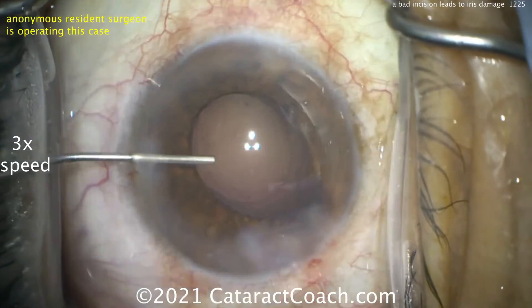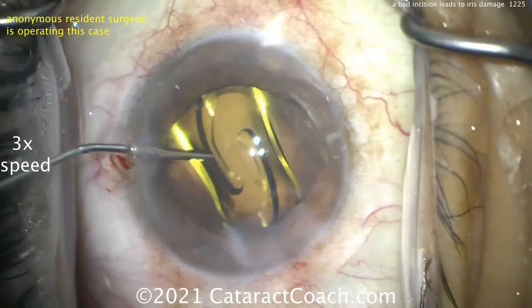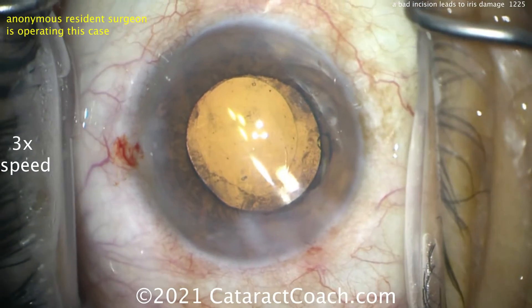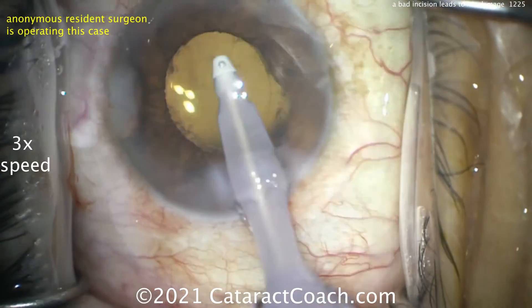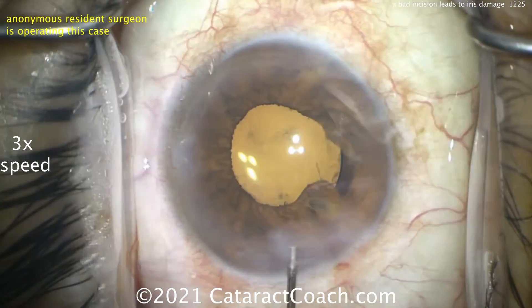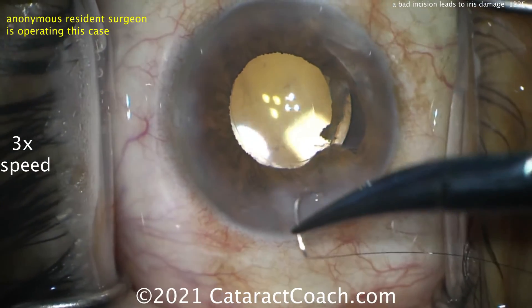Luckily, it looks like the case is going to be able to be finished normally. Putting in some more viscoelastic — let's see if we can get the lens in the capsular bag. Certainly put a suture in the incision at the end of the case. It's debatable whether or not to put a suture to try to repair the iris defect. If you're a beginning surgeon you can probably just leave it, and come back at a later date with a more senior surgeon. If you're more senior, you could quickly put a figure-of-eight pupiloplasty suture in to close that inferior defect.